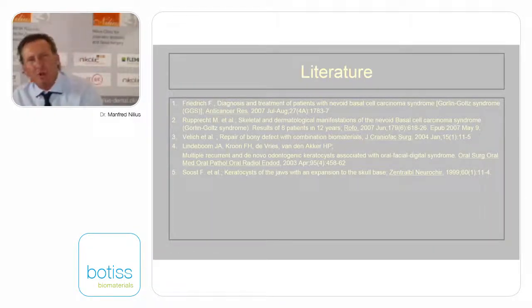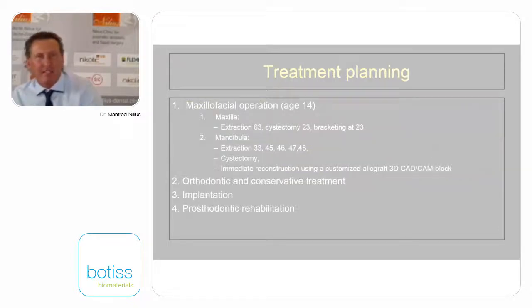When you do so in patients, there is not much information about how to handle kids. Normally, autologous bone you cannot use very well, because the hip graft is cartilage, not a very good conditioned bone, and the tibia is very bad because it's growing, so we decided to have an allogene made in different sizes.